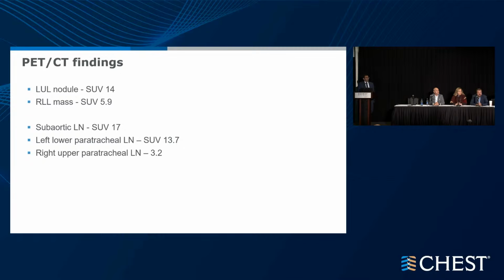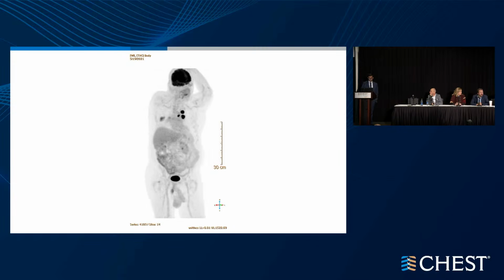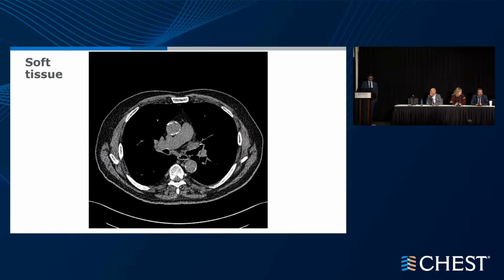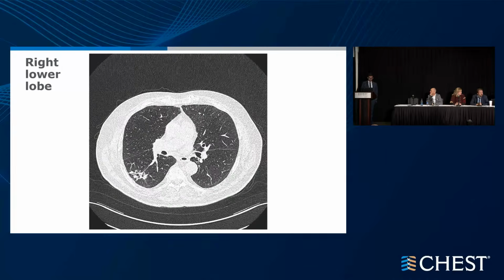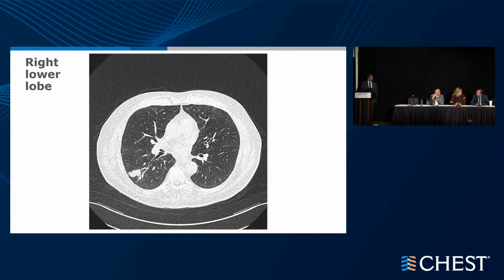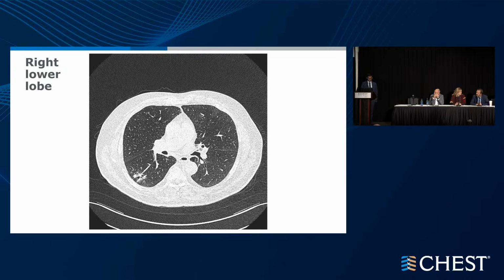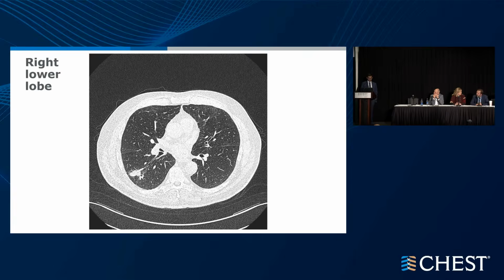Results justify it. Can somebody comment on the length of bronchoscopy and your chance of getting a diagnosis in that right lower lobe? Yeah, so the folks from MD Anderson have put together a couple of studies now suggesting that as time goes on, you start getting atelectasis predominantly in the lower lobes more often, or in the dependent parts of the lung. That's part of my decision making for navigating first: I don't want to deal with atelectasis in that lower lobe. And I'm pretty sure I'm going to go after that lower lobe no matter what, so I would get it done first.